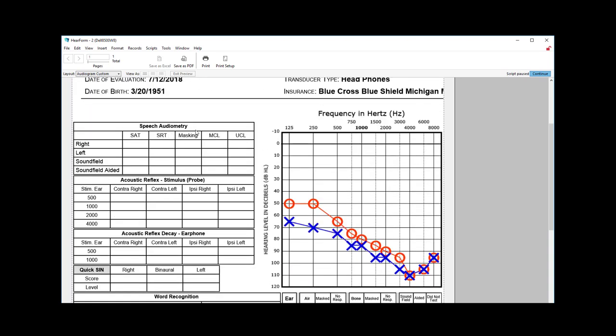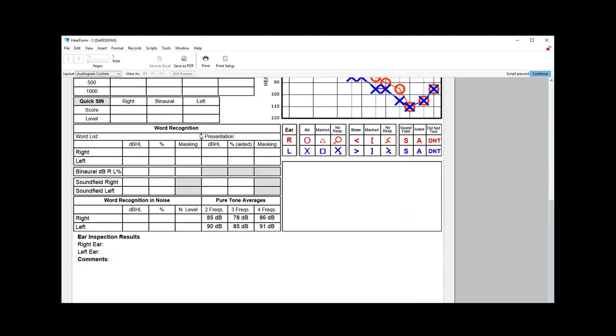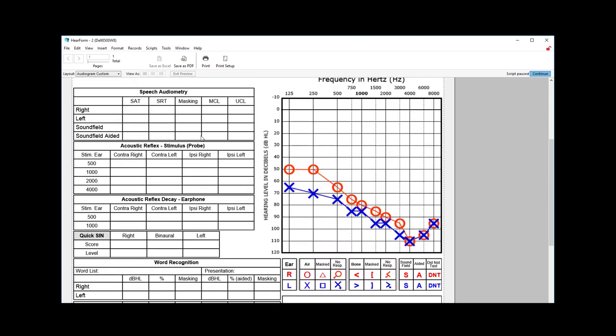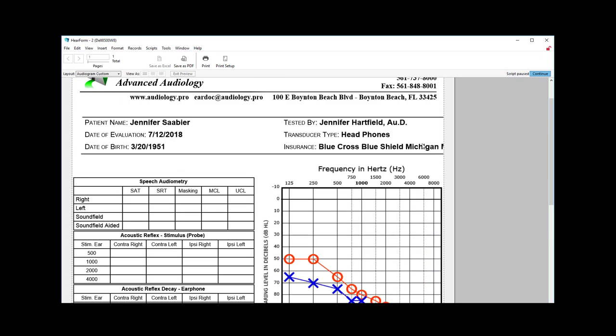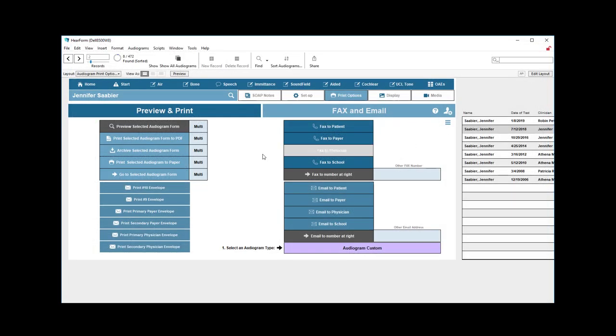We're showing speech audiometry, acoustic reflex, air and bone. You can customize this screen if you don't use, for example, acoustic reflex decay, and you want to get rid of that part, then talk to us, and we can help you with that as well. So all this information is here, and down below at the bottom of the audiogram is the ear inspection results for both the right and left ear and some comments. So that part, again, can be customized as needed. I just wanted to show you what that particular audiogram looks like.